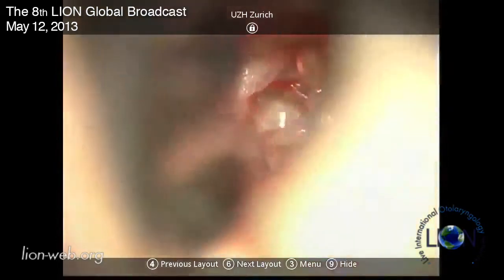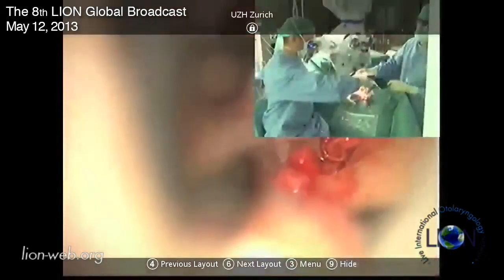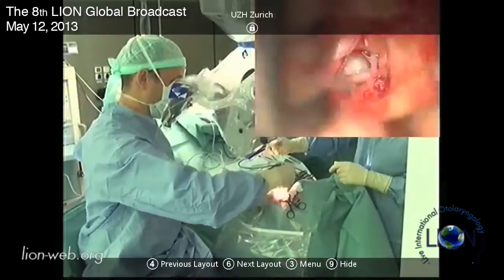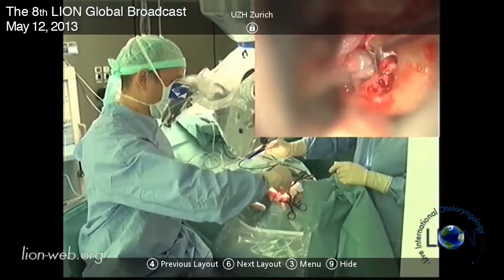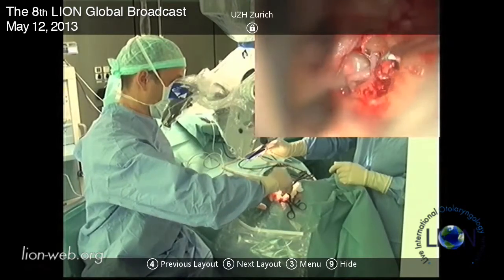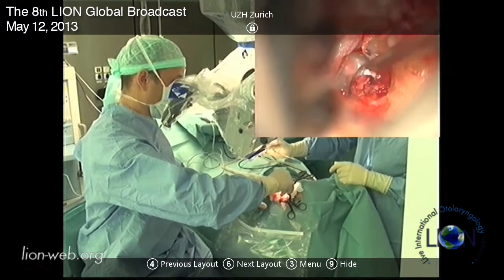What's interesting is you hear all of the stapes surgeons making the same comment - that they need to see the facial nerve and the pyramid. If you can't see the facial nerve and the pyramid you don't have enough access, and also if you're not using a smart prosthesis you have to crimp and you will not be able to get the crimper in at the end of the operation.